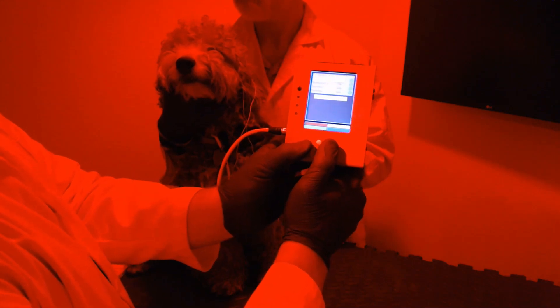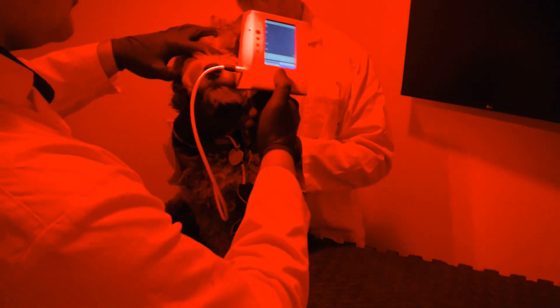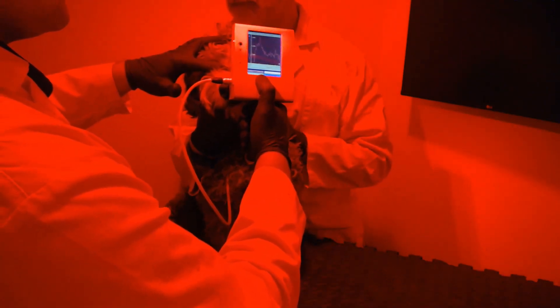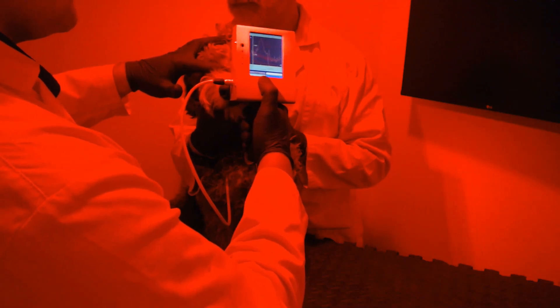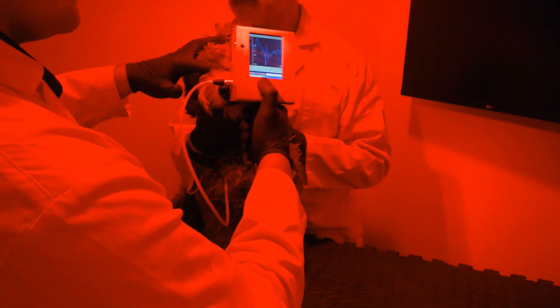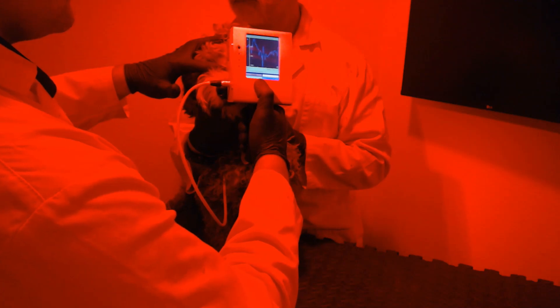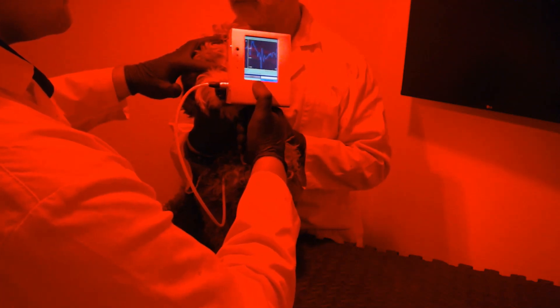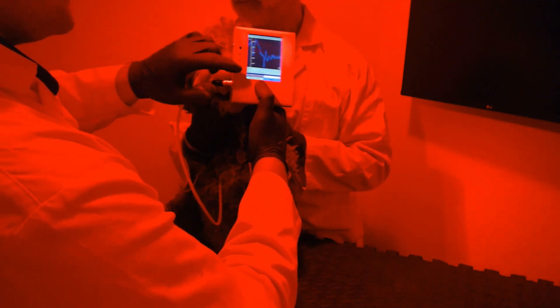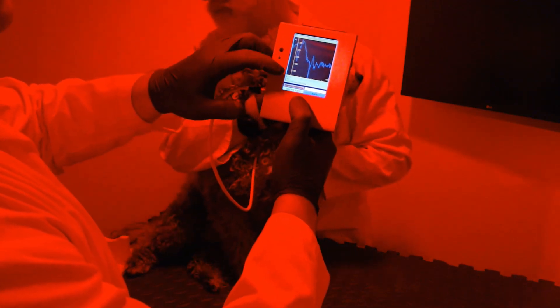Now we are ready to run the test on the dog's eye. We put the ERG up to the dog's eye and press run protocol. When the protocol is done, you will see 'end of protocol' at the bottom and the graph will display right on screen.